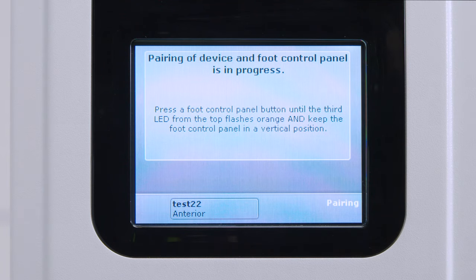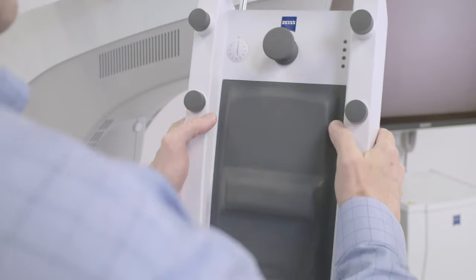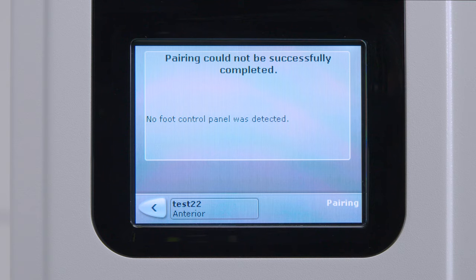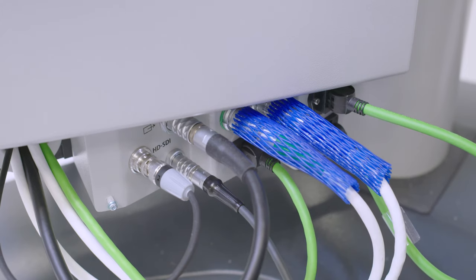If pairing fails, the touch screen will show pairing failed. Recheck that the CAN cable is not connected and that the foot control panel batteries are strong, then follow the pairing process steps again. If pairing fails after repeated attempts, attach the CAN cable and use the foot pedal wired. When appropriate, contact Zeiss Customer Care for further support with pairing.